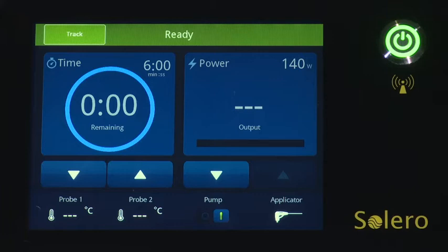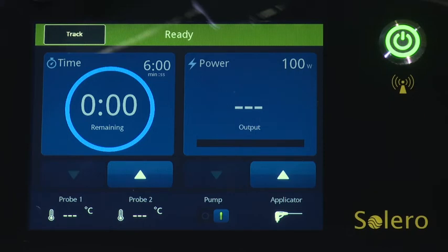If desired, track ablation can be performed during the removal of the applicator. This can be selected in ready mode by selecting the track mode button in the upper left corner. The generator defaults to 100 watts and the time may be set from zero to 1 minute and 30 seconds in 5 second increments. Take care to stop energy delivery once the applicator reaches the minimum insertion depth.